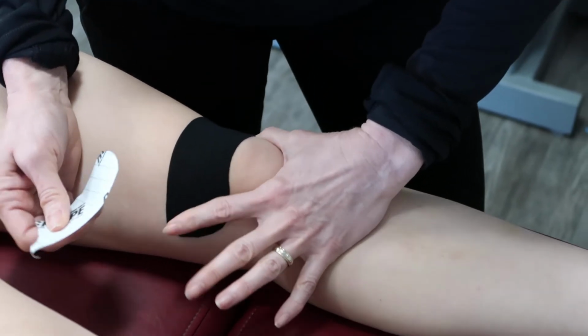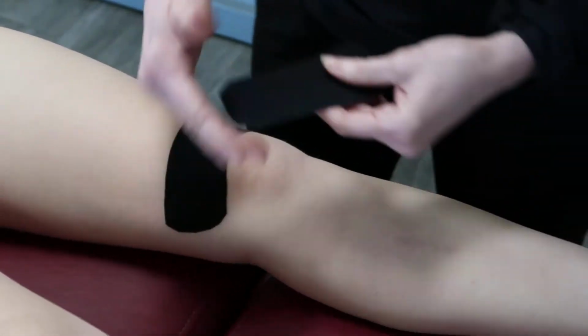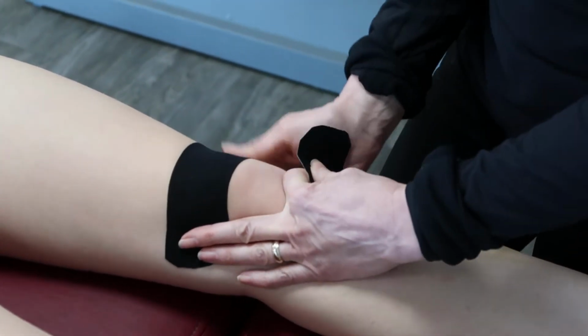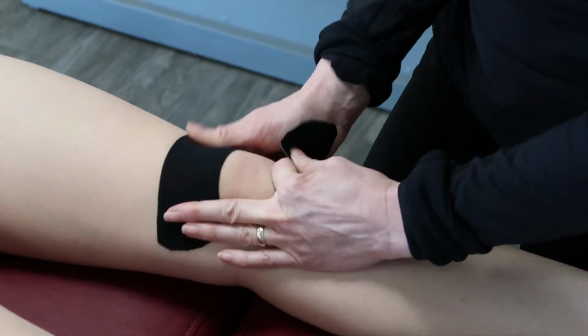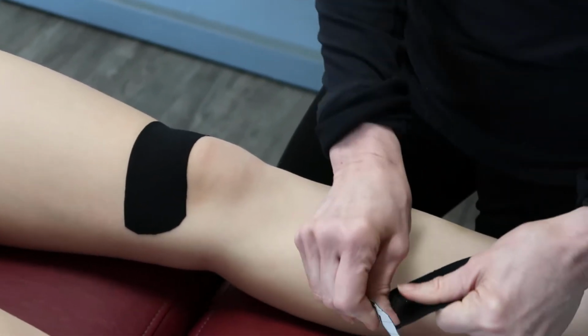If your patients are blistering, it's because you're pulling traction on that base. Okay. And then, of course, when we swipe down the tape, it's just activating the adhesive. And we want to make sure we do that adequately so the tape doesn't come off.